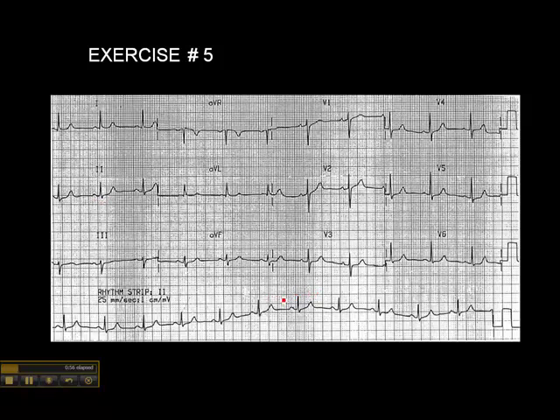What's interesting about this ECG is the wandering baseline. I included this because sometimes a wandering baseline will give you the impression that there's ST elevation when there isn't.